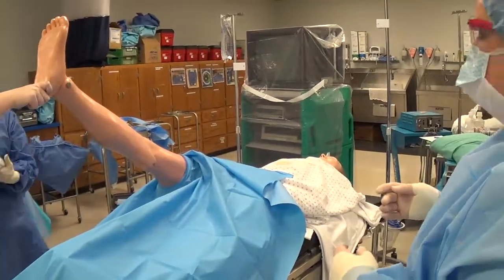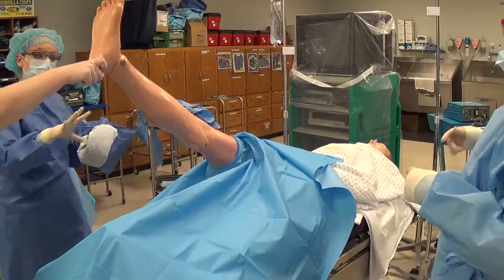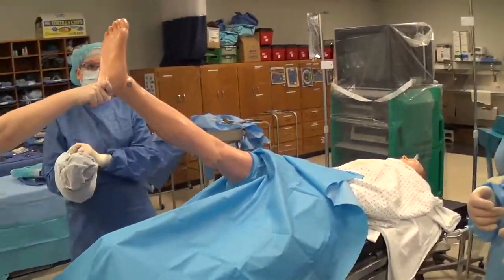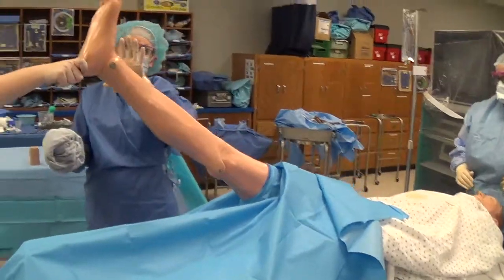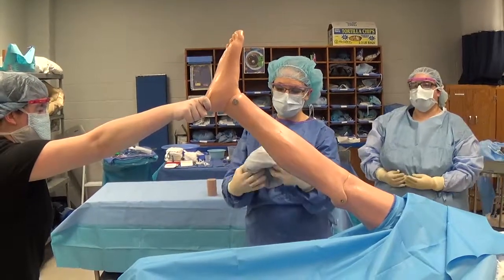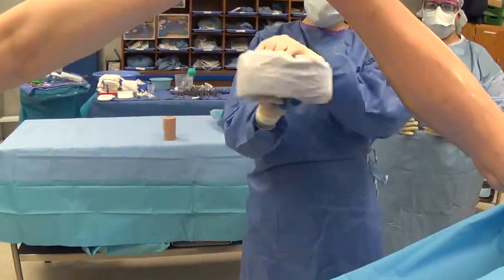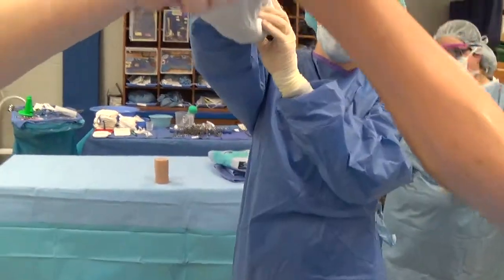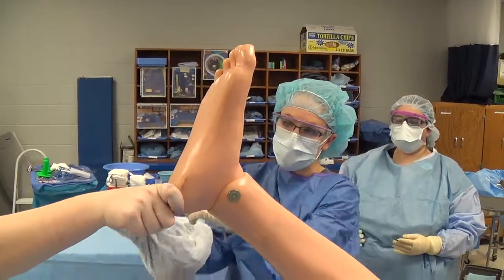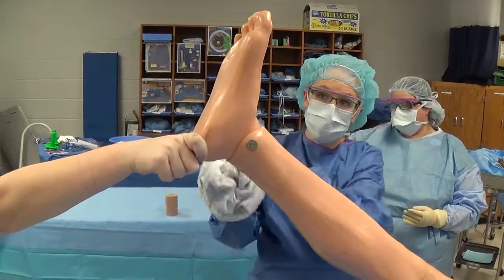If the foot has not been included — for example, if we are doing a knee case such as a knee arthroscopy — I need to place what's called an impervious stockinette over the top of it. This is what a stockinette looks like; it comes rolled in the pack. You're going to want to roll it back over your hand as you come to grab the foot, so that your hand doesn't get contaminated by the unsterile person holding onto the foot and the area that hasn't been prepped.